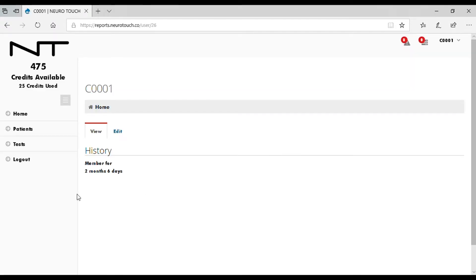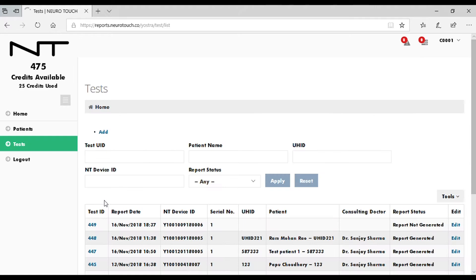Click on Tests from the left panel. The latest test data uploaded by the Neurotouch device will be displayed at the top of the table.